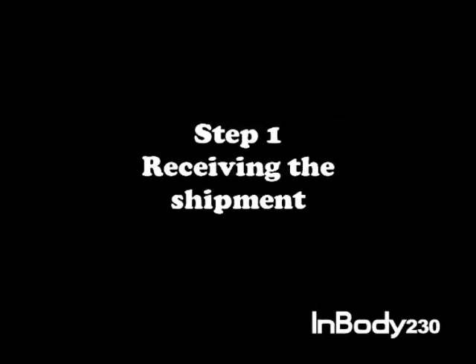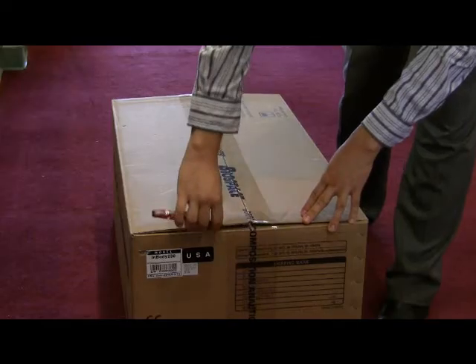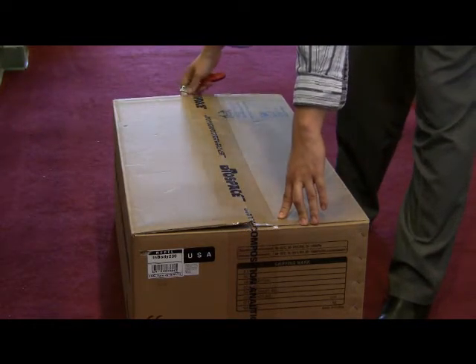Receiving the shipment. After placing an order, your InBody will usually arrive within three to six business days. It will arrive on a pallet and should remain horizontal to the ground as shown. Open the box and remove the top pad. Using a knife or box cutter, carefully cut the box open while being mindful not to press too hard to cut any materials inside of the box.